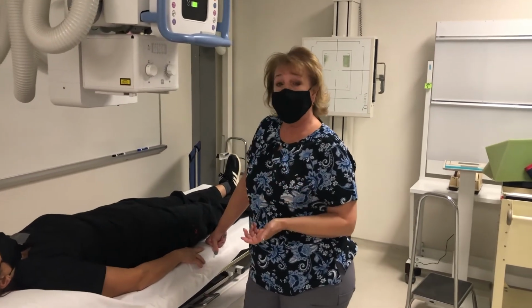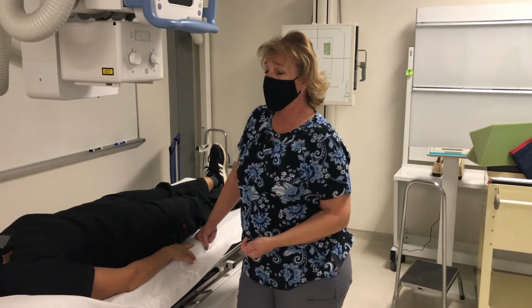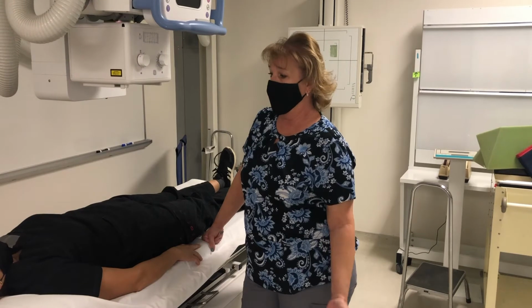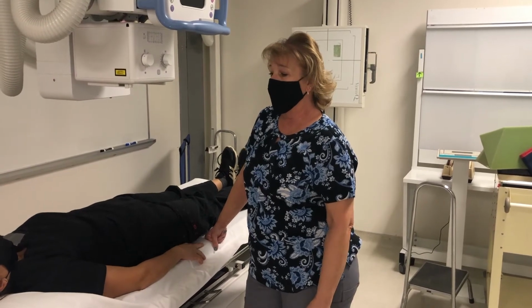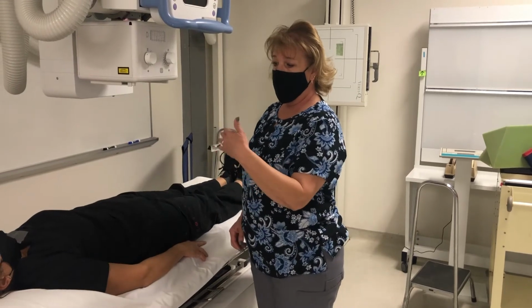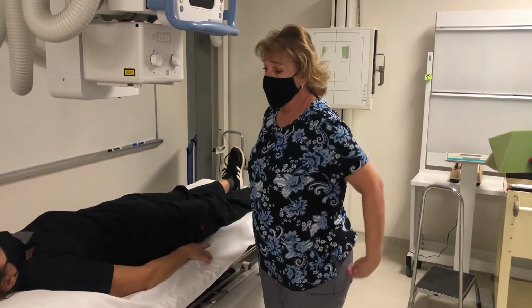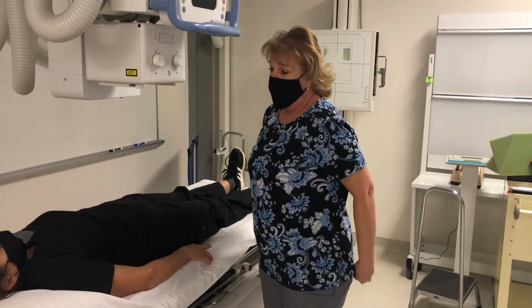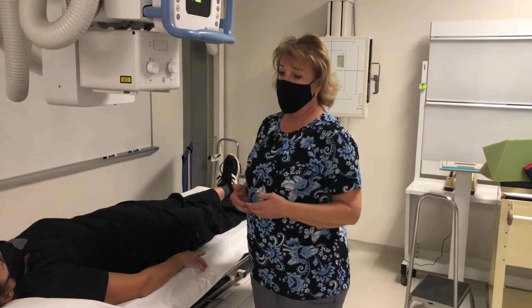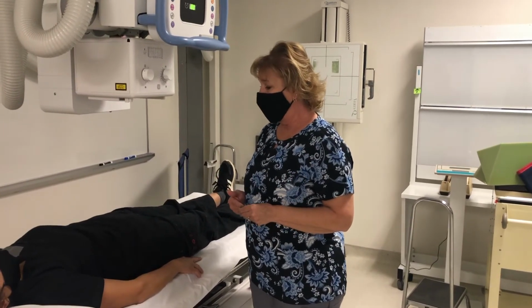So this is where you have small talk with the patient, maybe get a little bit more clinical history from them. How long have you been having these problems? Reassure them that as soon as their imaging is done, they can go have a normal breakfast. But this is our patient, we have to make sure that they're not having any kind of contrast reaction, and that would require us to administer Benadryl or any of the other drugs that we might have to give.